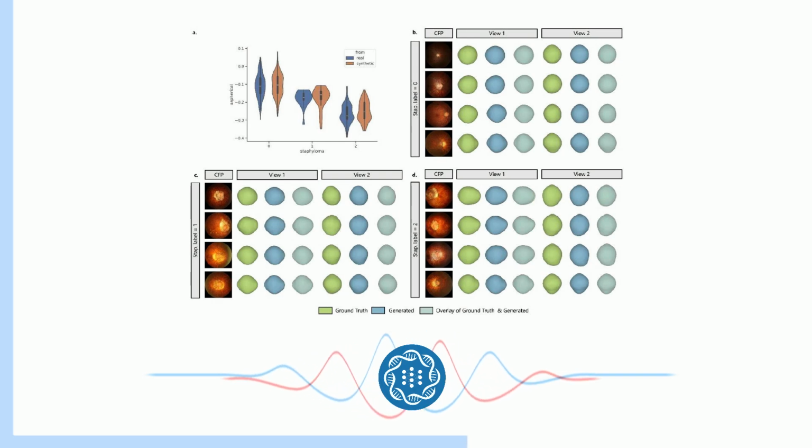Precisely. And then those measurements, like the axial length and the spherical equivalent, also get converted into a format that the AI can work with. This involves a technique called label distribution learning, which essentially smooths out any inconsistencies in those measurements. Makes it easier for the AI to process. Exactly. Got it. So we have the photo all summarized, those measurements all prepped. What happens next? All of that information, the photo features, the processed measurements, even whether it's a right eye or a left eye, all of that gets fed into that diffusion model.